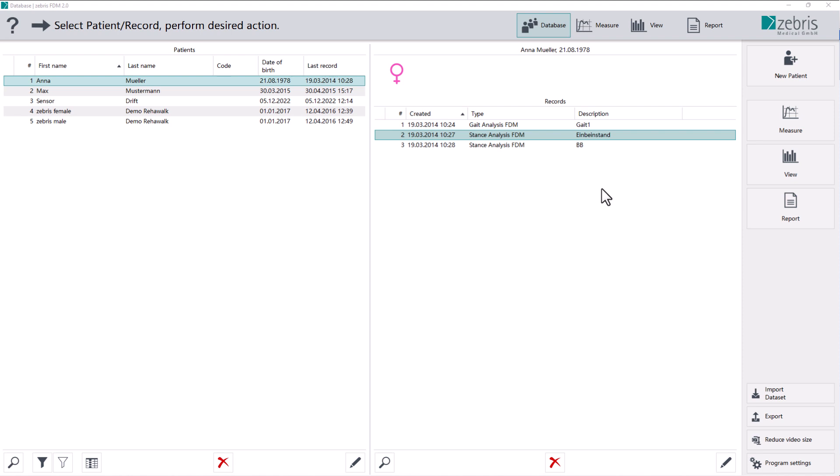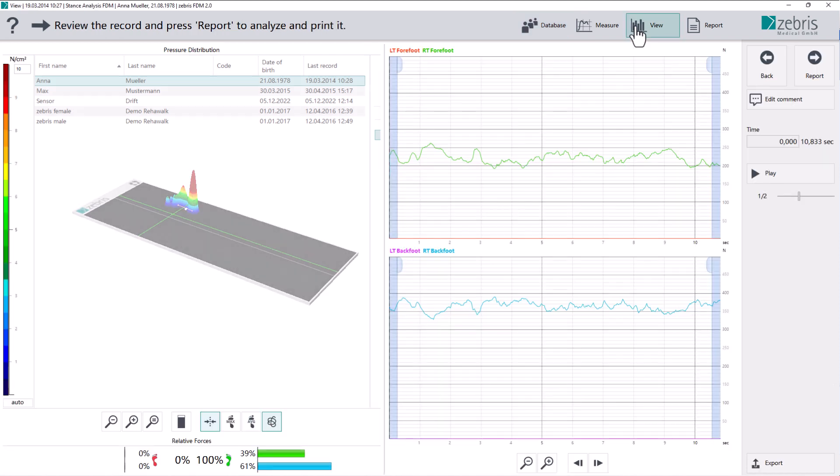The pressure scale can be individually adjusted. Select a measurement and switch to the view. This can be done either via the button on the right or the button above. The view opens.